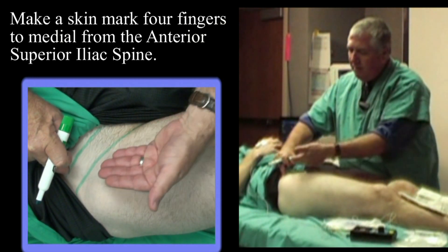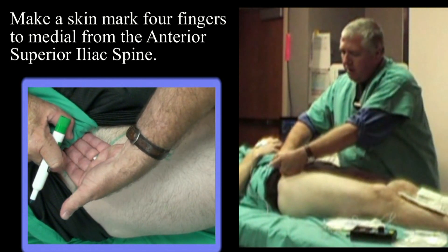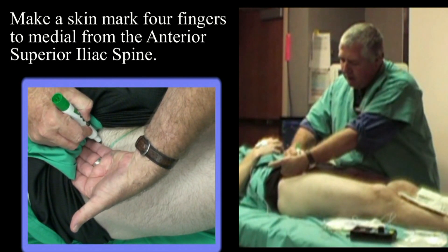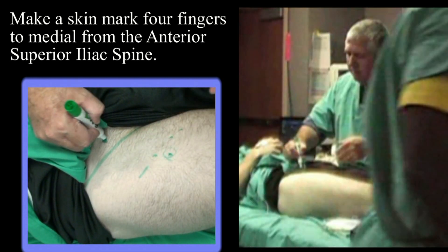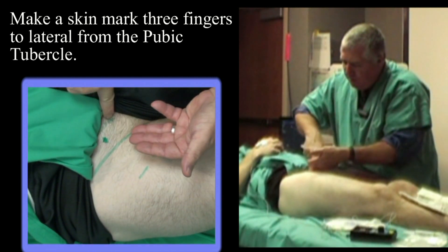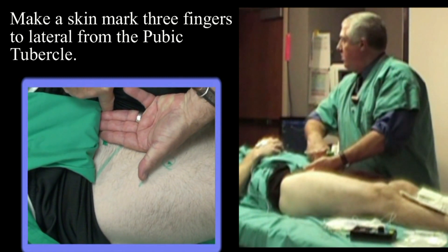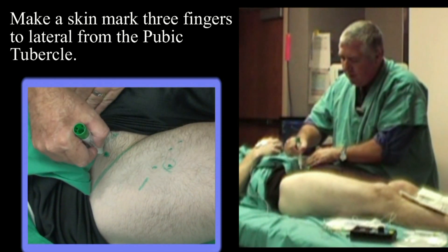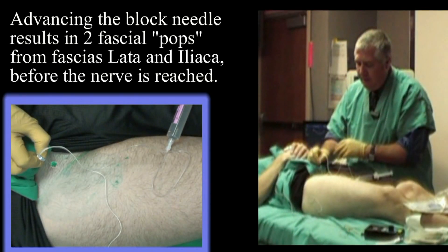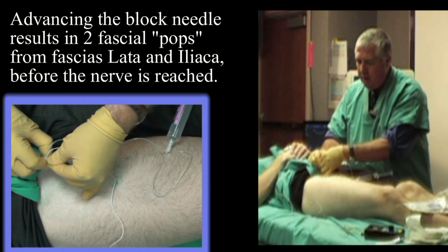For this four-three finger landmark method: place one finger on the anterior superior iliac spine, measure all four fingers of a standard block hand medially, and mark a spot 2 cm below the inguinal ligament. Verify it by placing a finger on the pubic tubercle and putting three fingers next to your finger — three fingers should bring you back to that mark. That's the spot for the femoral nerve block. This only needs a 50 mm needle. I am going to pop through skin, and I like a fast twitch.